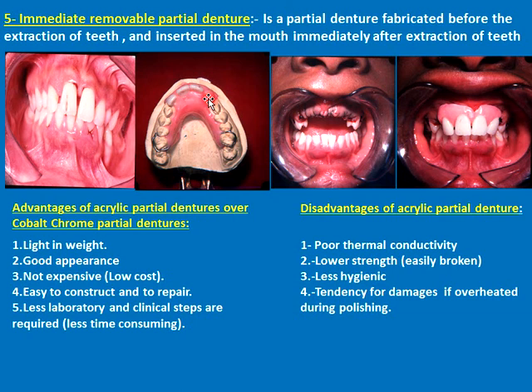We make impression ونبدي we remove the teeth from the cast and we set the artificial teeth which are going to be extracted. وهاي الanterior teeth هي راح تعتبر إنها as a guide regarding the size, the position and the color. Usually we should set it in the same way as the teeth that are going to be extracted. When the partial is ready, the teeth are pulled out, and immediately the immediate denture is placed in a place here, which almost it is identical to what the patient had.